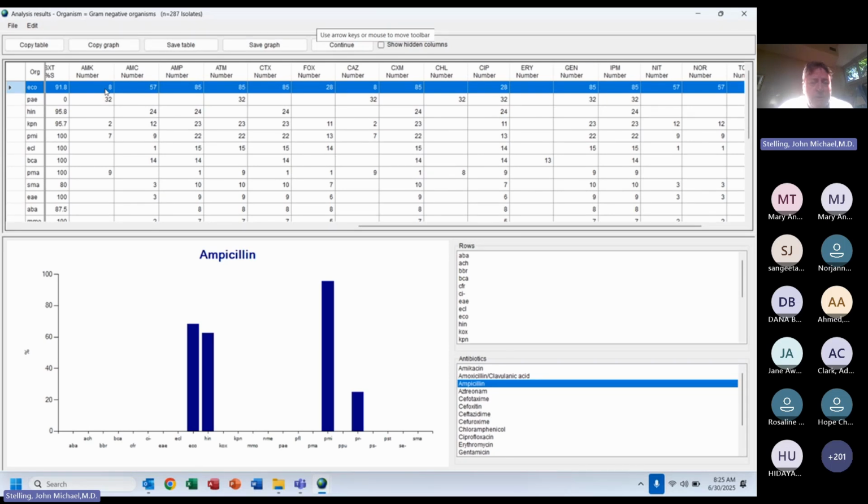And these different things are introducing different kinds of bias. Nitrofurantoin, it doesn't bother me. I'm not getting overall statistics for all nitrofurantoin, but I'm getting nitrofurantoin statistics for urine, which is fine. That's what the drug is intended for. So I'm not worried about that kind of bias because it is appropriate for this organism.